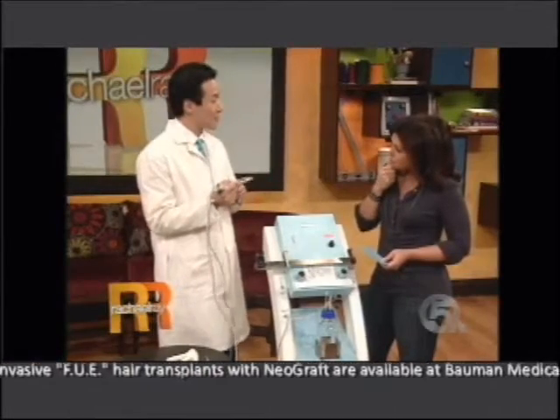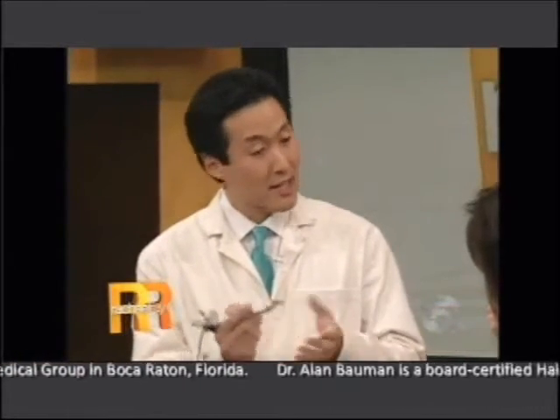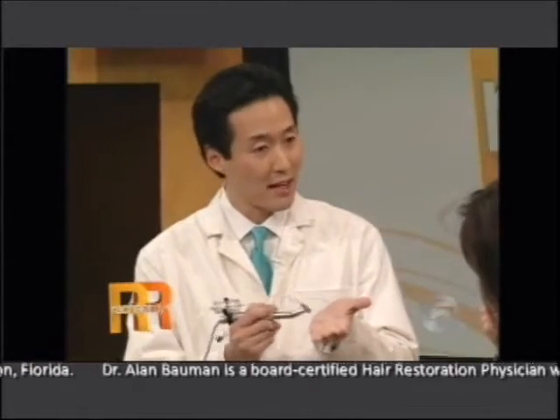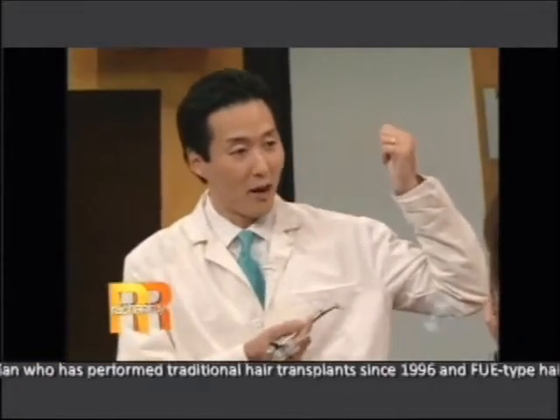Now, the other benefit of this is in the past, we can really only take hair from one part of our body, just the back of our head, because you'd end up with a large scar. With this, because we're punching it out, hair by hair, you can technically take hair from your chest and put it on top of your head. You can take hair from your back, and even theoretically, you could take it from your armpit and put it on top of your head if you really wanted to. Really? You had to put that in my head? It's theoretical. Take that back.